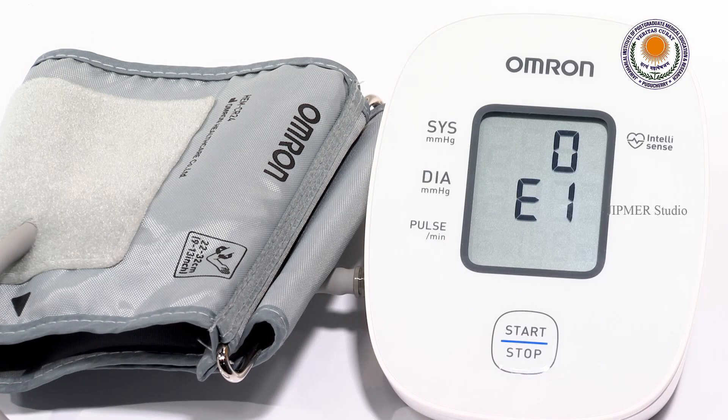If any error shows on the screen, try disconnecting and reconnecting. To be more precise, take a repeat measurement of your blood pressure and record the average of the two readings.